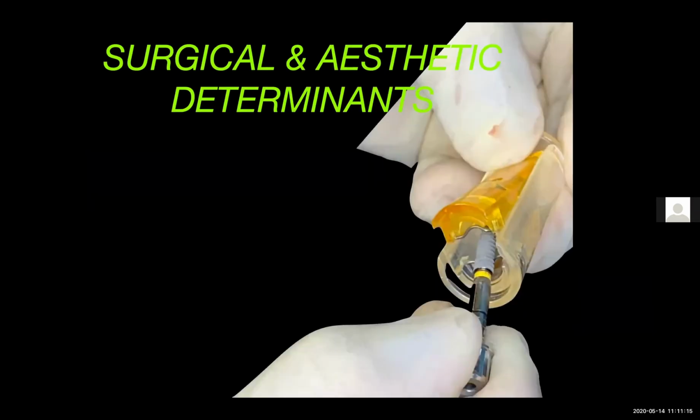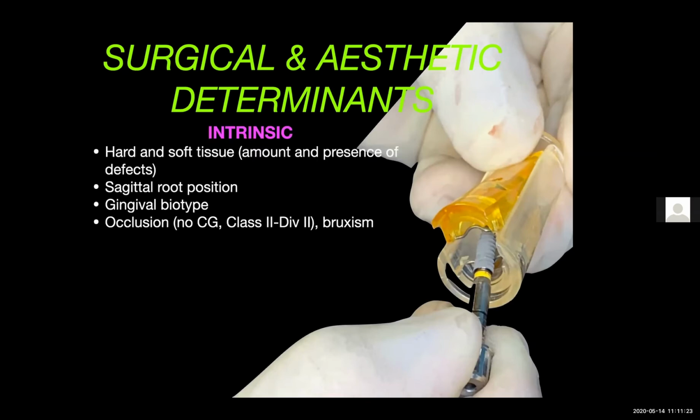So in a nutshell, we have two sets of controlling factors which work together to determine the surgical and aesthetic outcomes of the anterior implants. The first determinant we look for is intrinsic. Intrinsic is how the patient presents to you, the information you collect from examination and radiographic imaging. And in terms of anterior implants, it's important that you document the availability of hard and soft tissue and the presence of any periodontal defects prior to the implant placement.